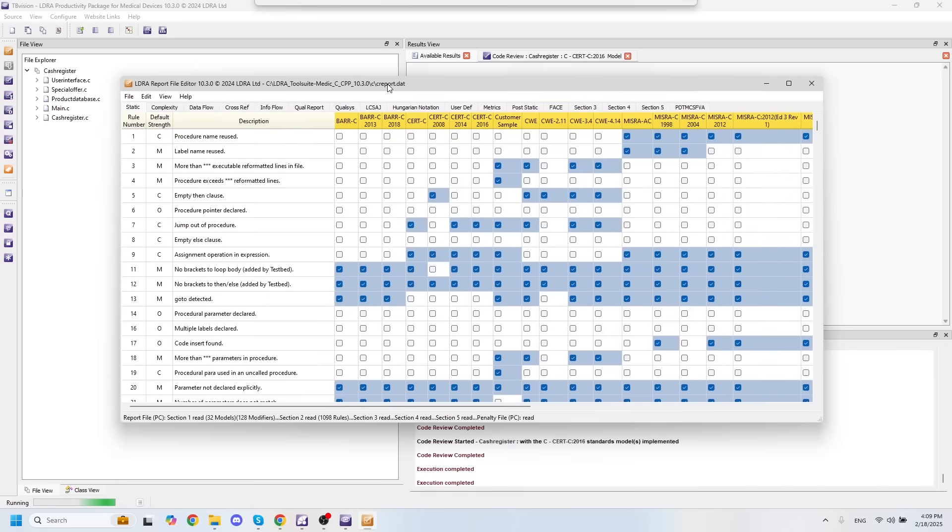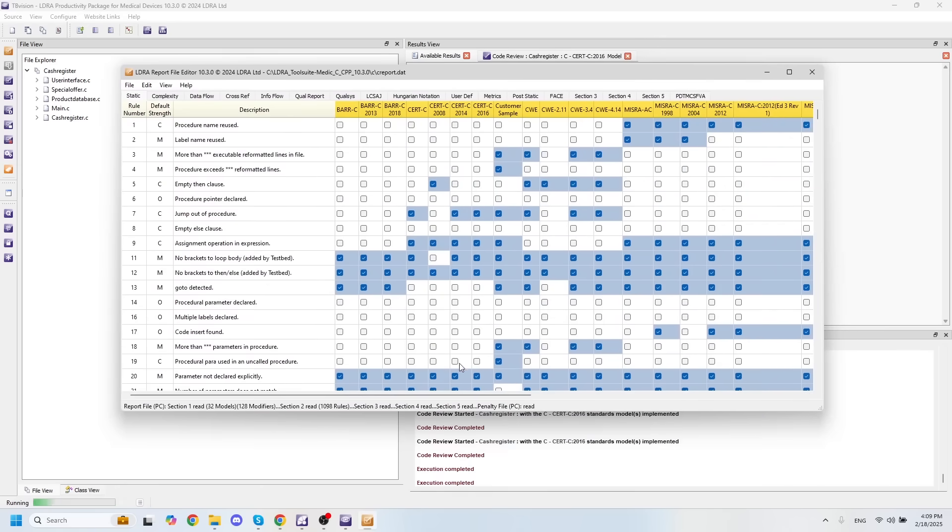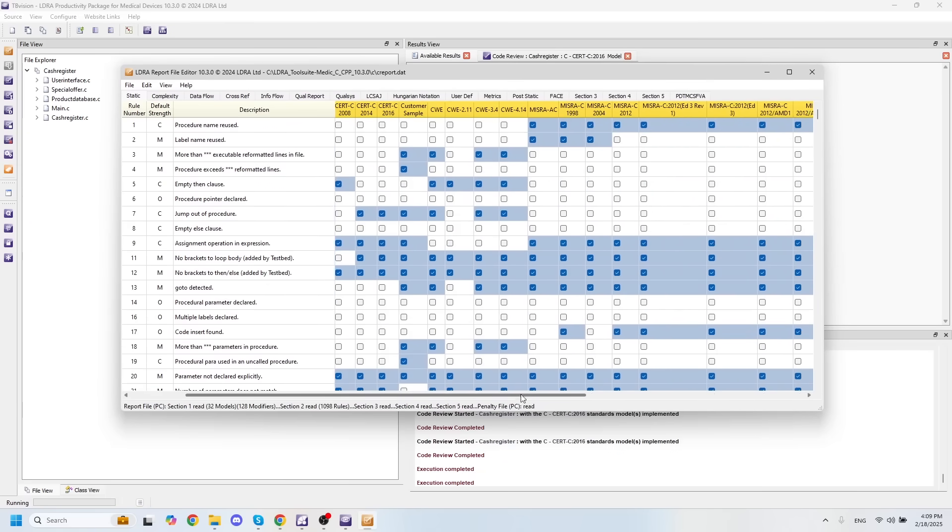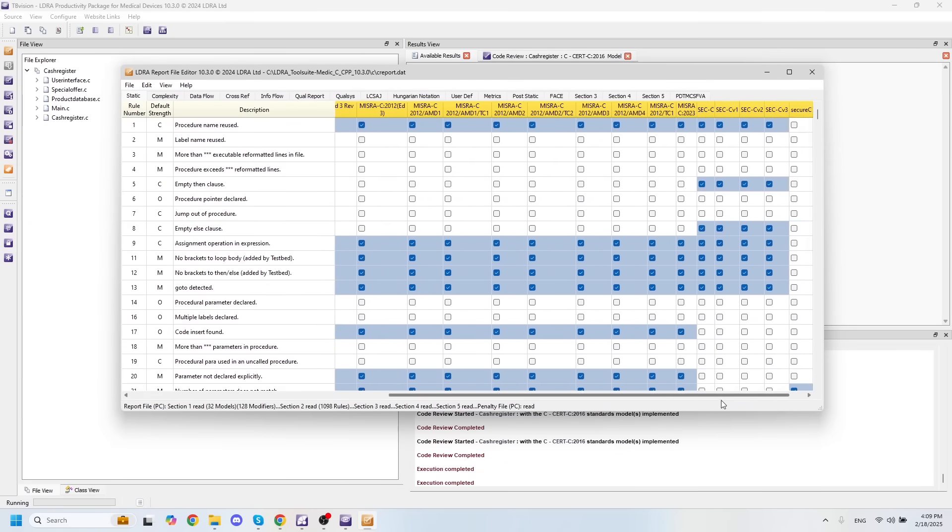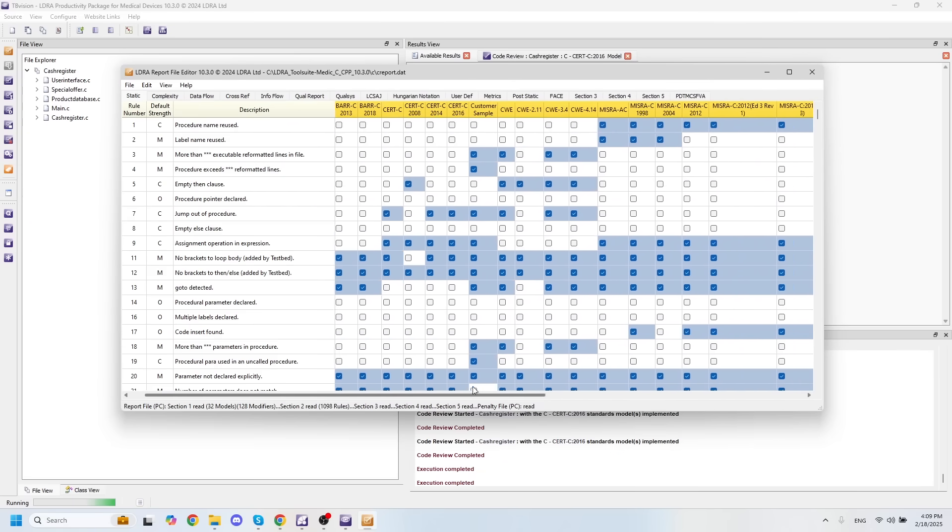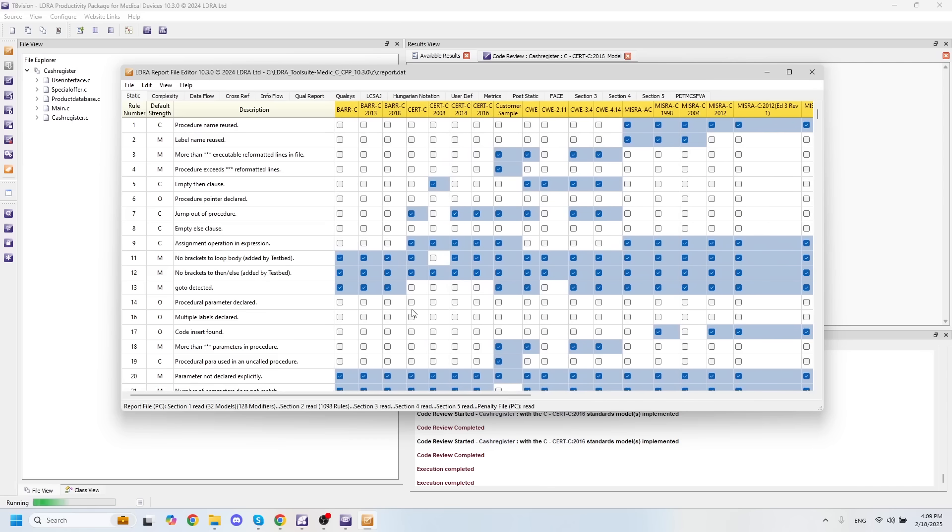At LDRA we have over 30 different standards for whatever industry you might need, as well as the ability to customize from our list of over 1,000 different rules and regulations that you can customize in each of these individual standards.